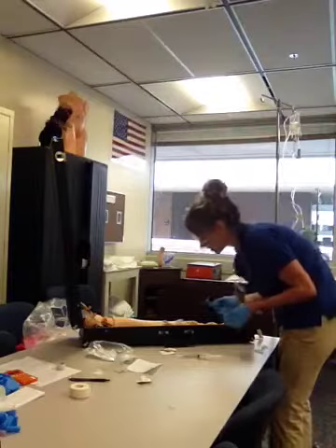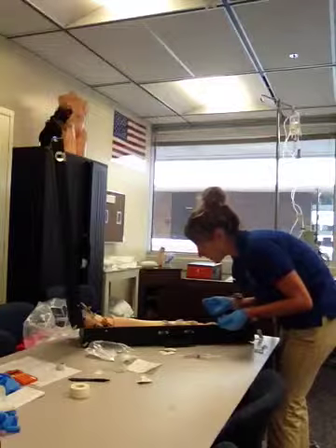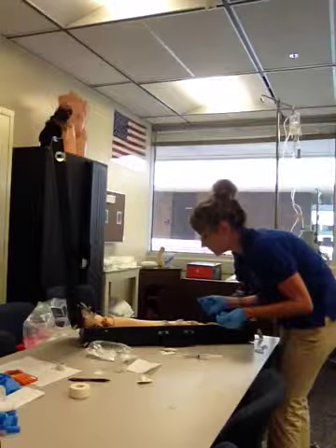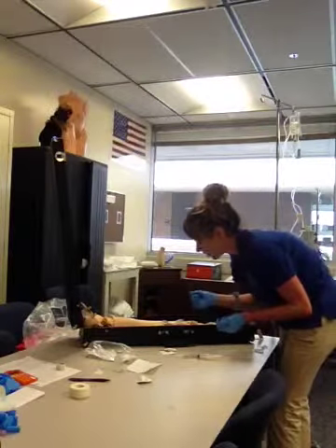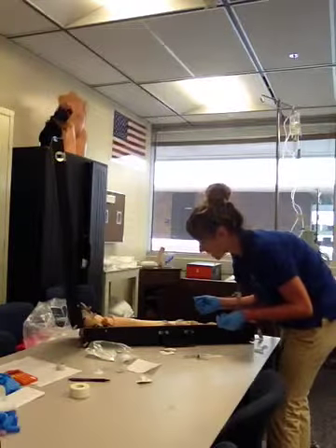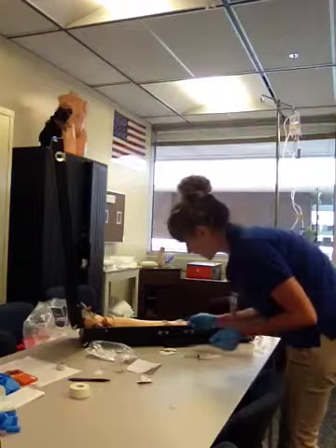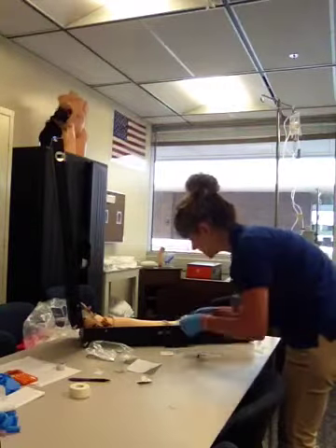And now I'm going to assess the existing IV site for any signs of phlebitis, redness, swelling, edema, drainage, or bleeding. Also, if it's cool or leaking, being a sign that it has infiltrated. And the site looks good.